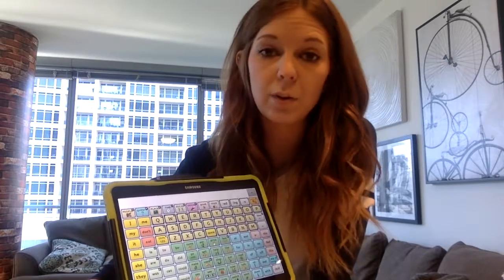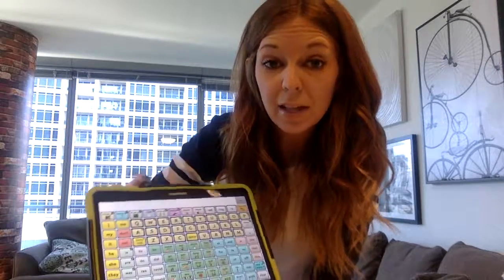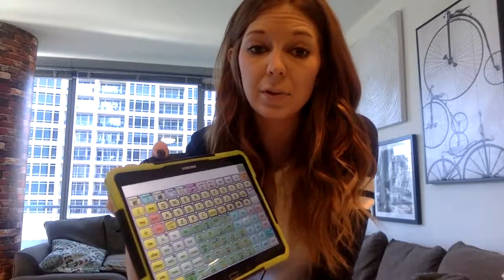This is something that can open up doors in all environments in their life and can really make their life a lot more enjoyable, because you're getting social interaction and you're being able to tell people exactly how you feel and things that you want, things that you need. So I've seen some amazing success stories for my students, some that are 5 years old and some that are 22 years old. So I know that it definitely is successful and can open up a lot of doors and be a life-changing support system.